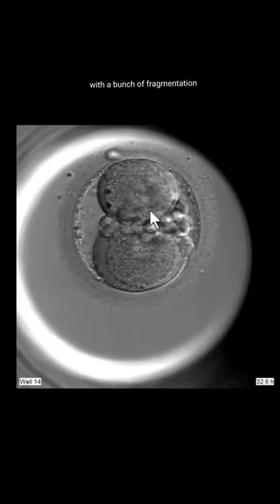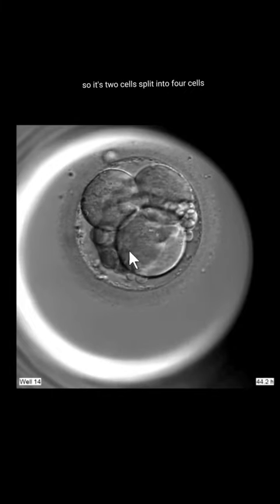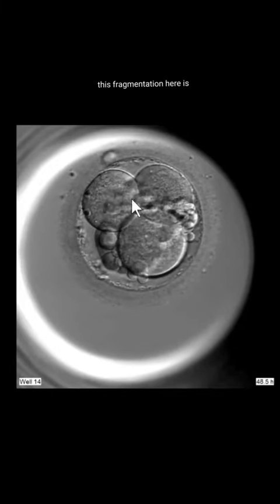All right, now they're gone, so they fused. Now the one cell splits into two cells with a bunch of fragmentation, you can see there. So it's two cells split into four cells. This fragmentation you can use to evaluate the quality of cleavage stage embryos. They're just basically fluid-filled sacs. So part of the cell will pinch off and form these fragments.